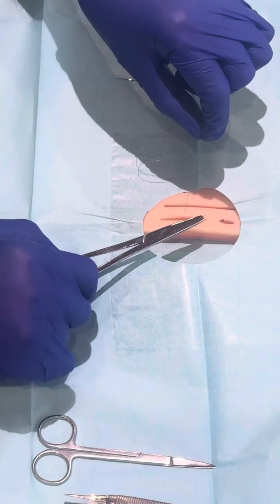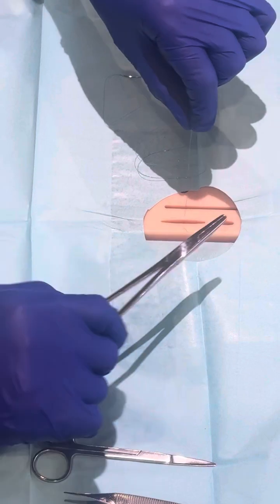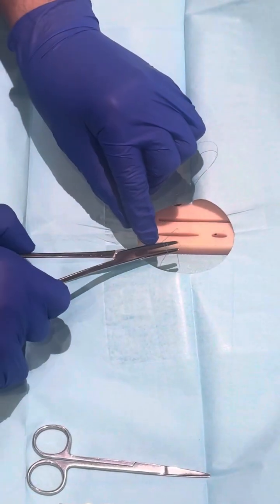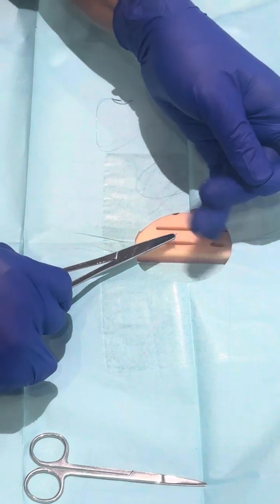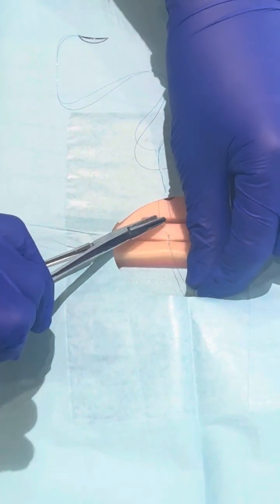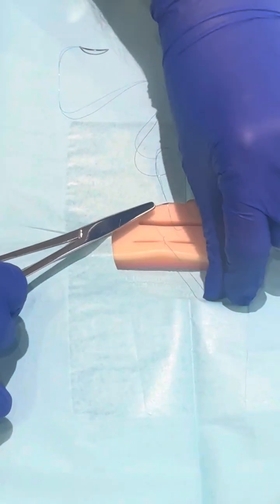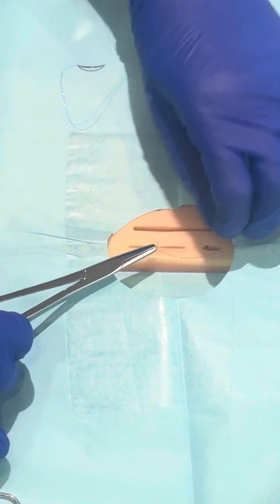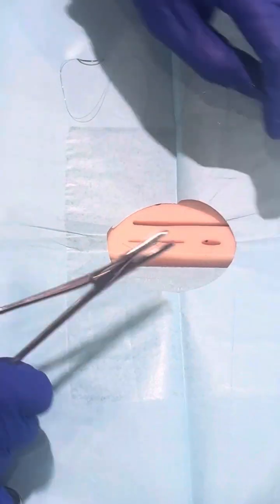and then 2 throws first, grab the tip as much as possible of the other end of the suture, not to strangulate it, just to make sure that they are near each other on the edge of the wound.